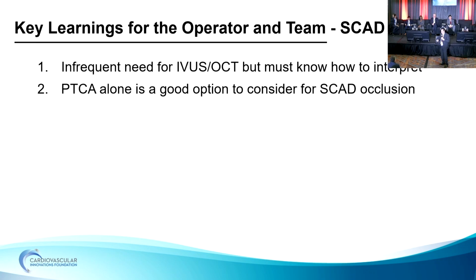So the key learnings, I think angiography alone suffices in most, an infrequent need to do intravascular imaging, but if you do it, especially digital IVUS, scrutinize it carefully. And I would strongly urge for balloon angioplasty alone in occlusive SCAD. Thank you.